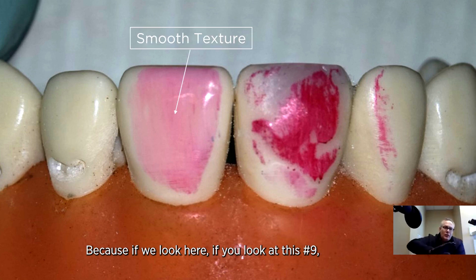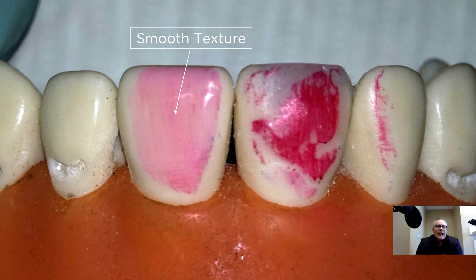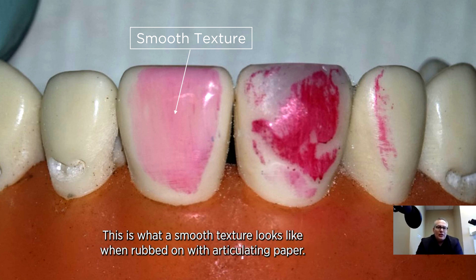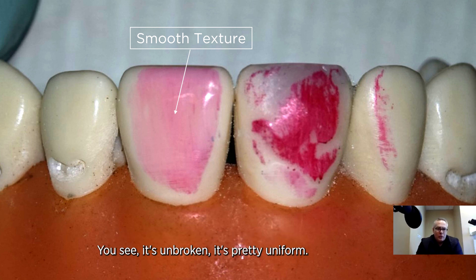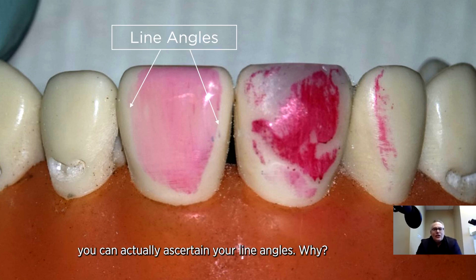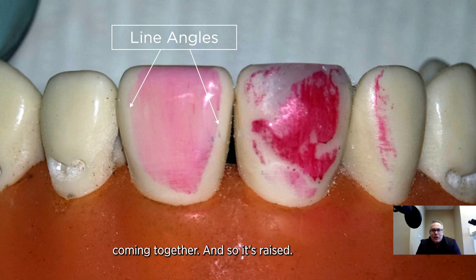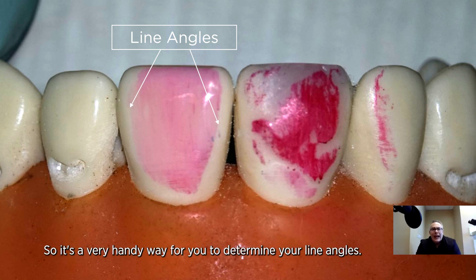If we look at tooth number nine — which is upside down, or the 21 — this is what a smooth texture looks like when rubbed with articulating paper. You can see it's unbroken and pretty uniform. The advantage of using articulating paper is that if you rub it and get used to rubbing it, you can actually ascertain your line angles, because the facial and distal line angles come together and are raised. So it's a very handy way to determine your line angle.